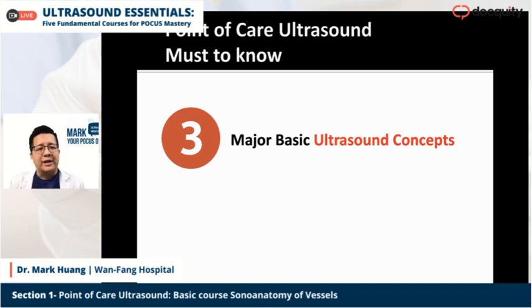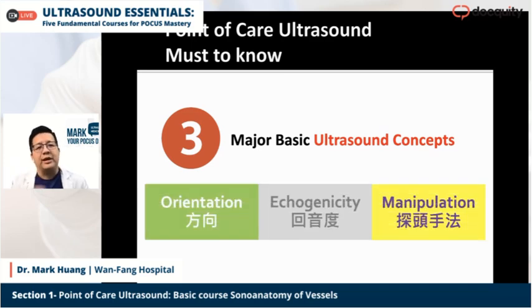Some very important concepts. You must know 3 things. Before we start our course, I have introduced this concept first. The 3 major basic concepts include these 3 things. The first one is about the orientation, 中文叫方向, okay?